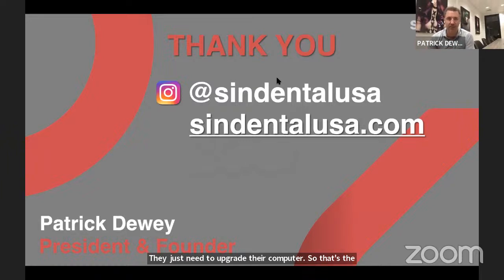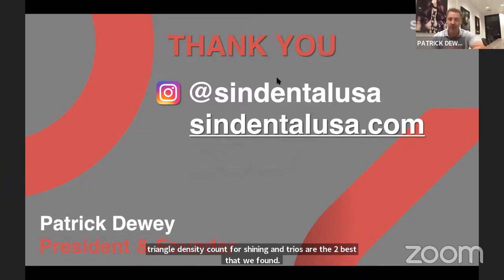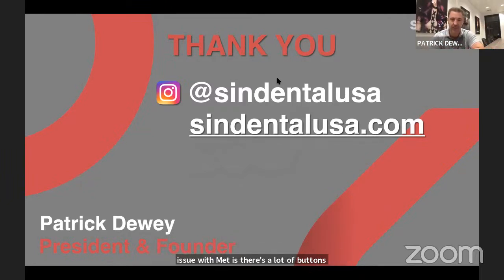If for some reason there's something wrong with the scanner, but in regards to the brands, Trios scans great. Shining 3D scans amazing. The triangle density count for Shining and Trios are the two best that we found. Medit is also strong. Medit's a great scanner. The only issue with Medit is there's a lot of buttons, so the assistants can get a little bit confused, but Medit is a great scanner as well.